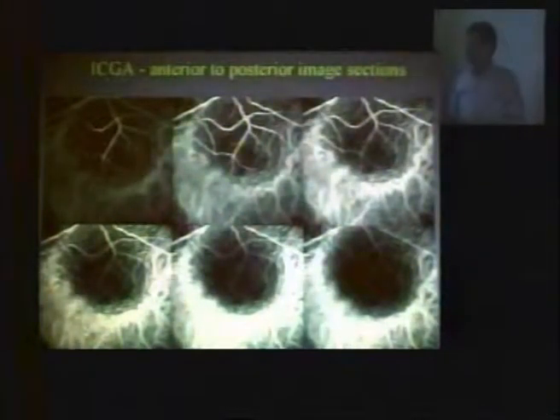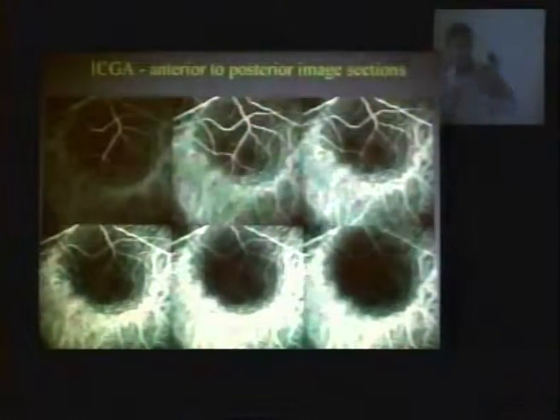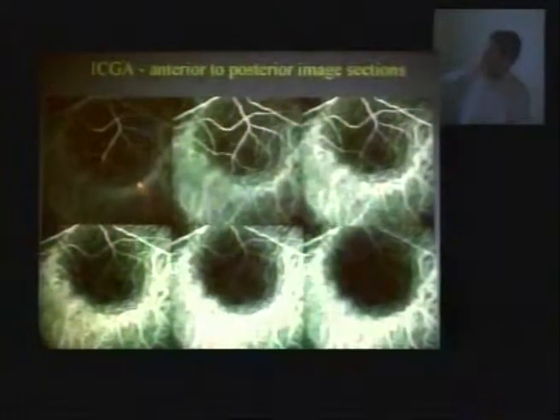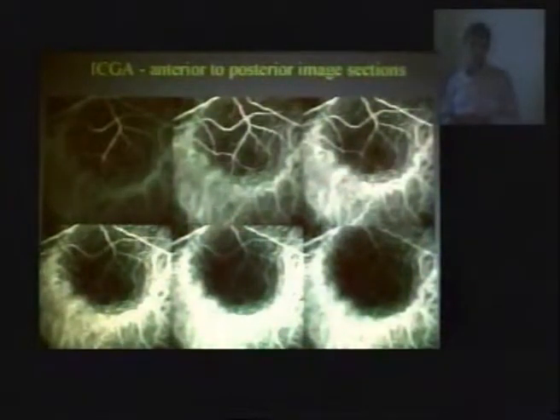It's like a tomograph, it does slices. Now we see here, the maximum illumination, that means we are in focus. In this system, it does not get fuzzy like with a regular camera, okay? It gets dark because of the pinhole. If it's not in focus, it's dark. So here, okay, you see this blood vessel? It is sharp, but it is dark. Here, it's the same vessel, the same sharpness, but it's bright because it's in focus.